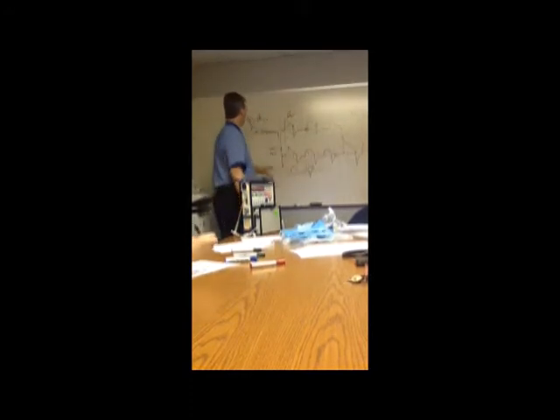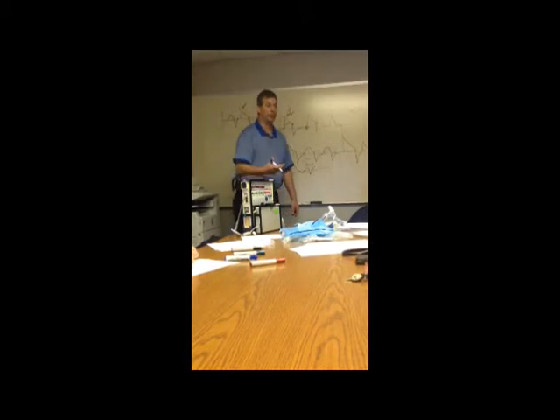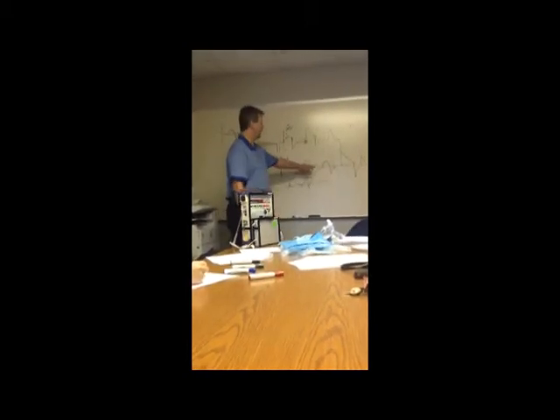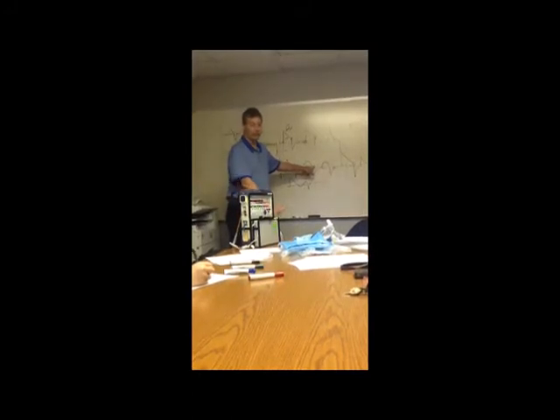And if you did that without pressure support at all, you'd still have flow going in and flow coming out, but the pressure in the circuit would never increase. So they would basically be breathing through a straw, and they have to do all the work. Okay? So that's why when we're weaning, we always add at least 5 of pressure support to overcome the circuit and the work of that.